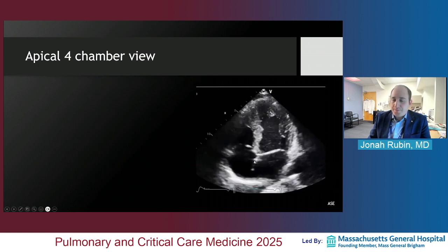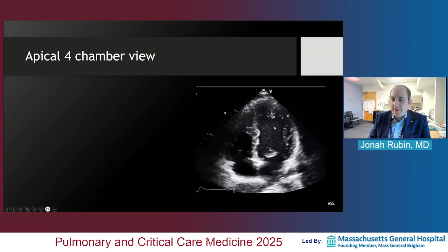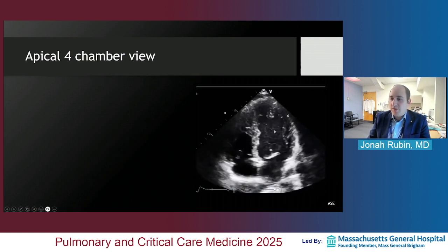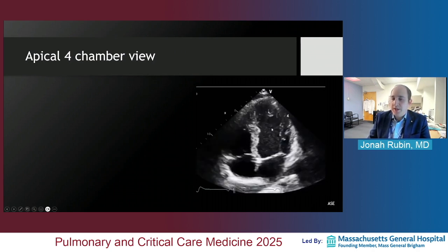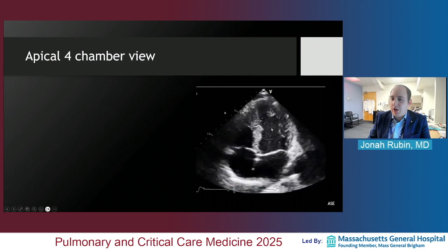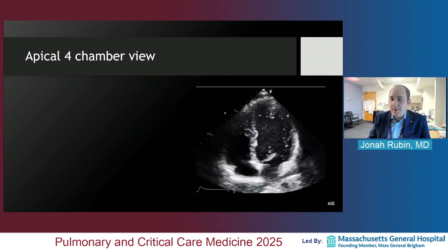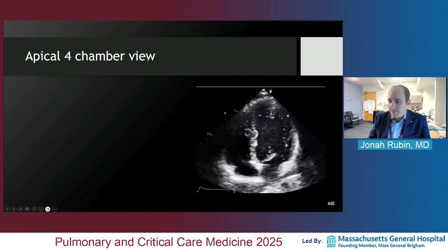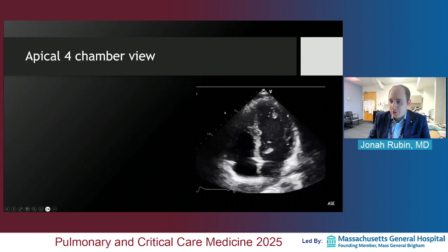You can also look at the chamber contractility, so to speak, the fractional area change or fractional shortening, what people might call the EF, by just your overall sense of how much the heart is contracting and ejecting with each beat. So similar to the parasternal long axis, you can assess all three features: excursion, that longitudinal motion; thickening, that sort of horizontal motion; and also chamber change.